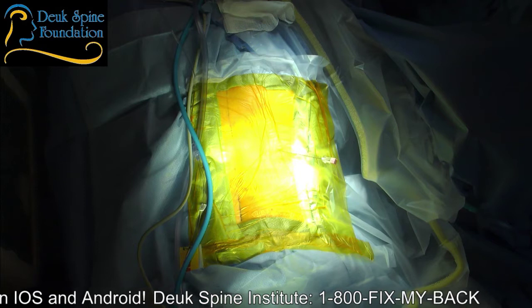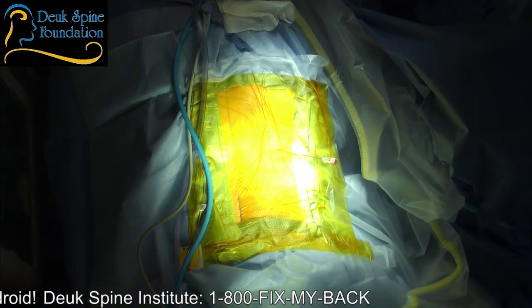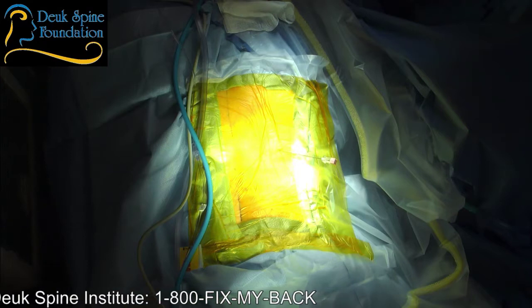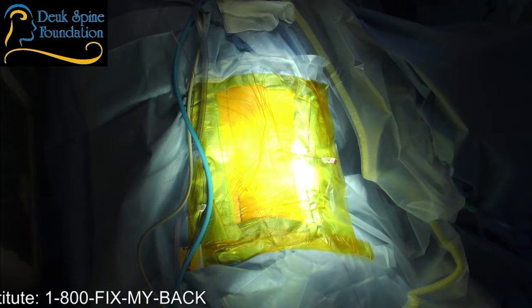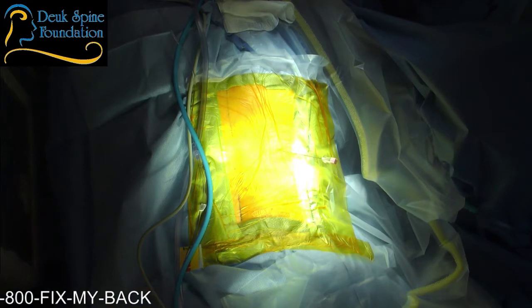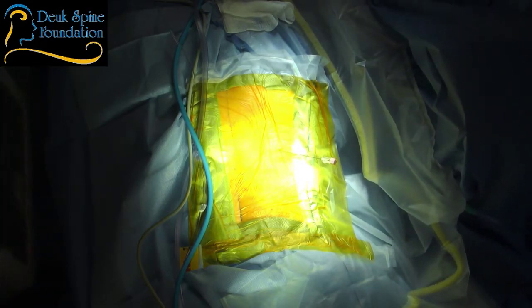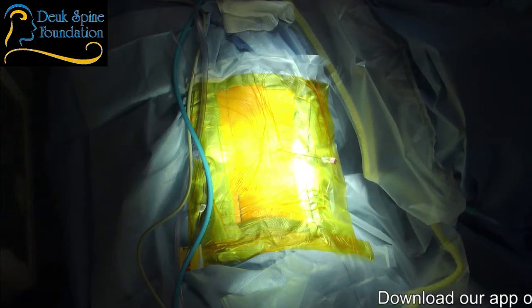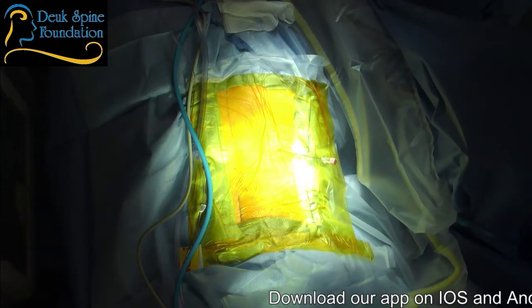Okay, so on the fluoro shot, I need your help. We usually start with an AP on the lumbars. So what I need you to do is wag it. Let's just stick with the lateral for now, since you're already here. So folks, if you're watching, you can see the screws and rods from the prior surgery. We're aiming for the disc at the bottom of the spine. And we're going to wag the fluoro to try to line up the end plate a little bit better.